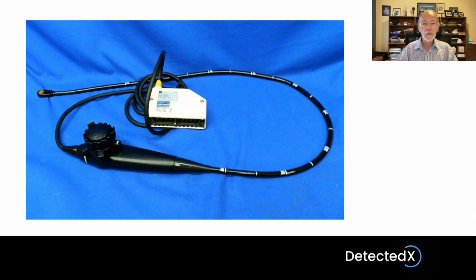So in the pelvis, for example, we have major problems with air and with gas and bone, and therefore it's quite common to use transvaginal probes and transrectal probes to look, for example, at the prostate. Here we have a transesophageal probe, which is used in echocardiography. So the aim is that the probe tip gets very close to the aortic outflow tract and therefore produces very nice high-quality images from close up to the target tissues.